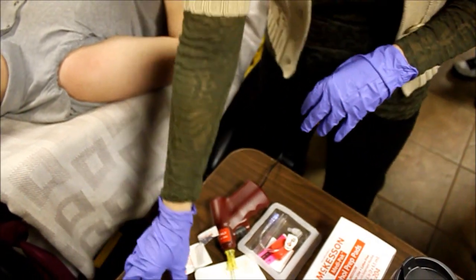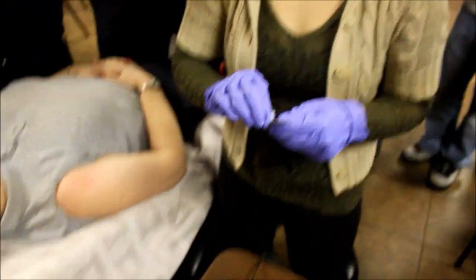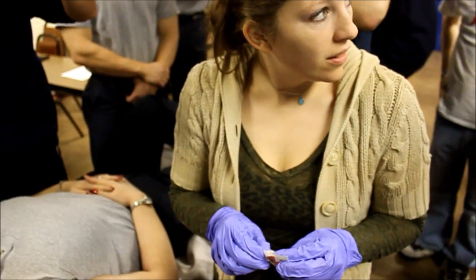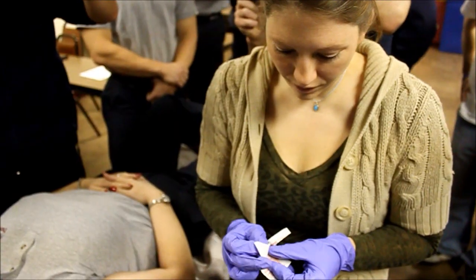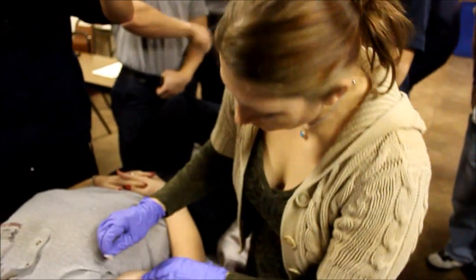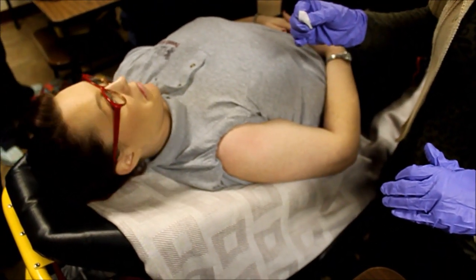The way we were taught to prep typically was always to go in a kind of circle, and now they're saying it's better to go up and down, then side to side, and up and down and side to side for 30 seconds and then let it dry. That's if you're using chlorhexidine or betadine. But I like the circular approach — take the center and work your way out.